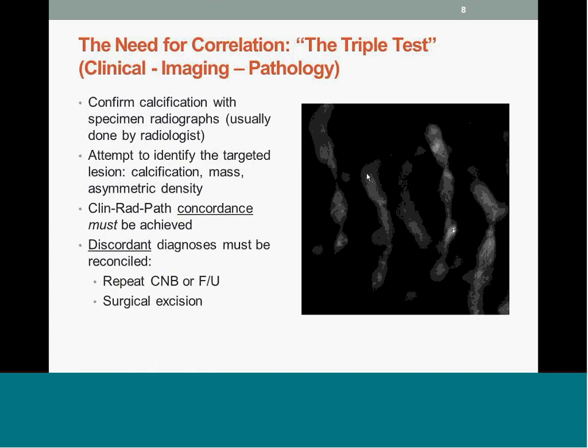For discordant diagnoses, there has to be some attempt at reconciliation, and we'll talk about this later. I will specifically state in my reports that some sort of repeat core biopsy should be attempted, or some sort of final path correlation should be performed.